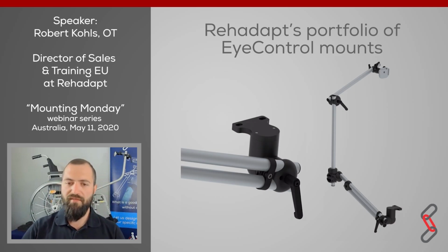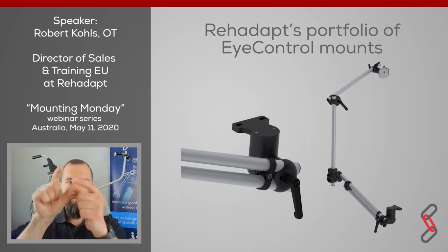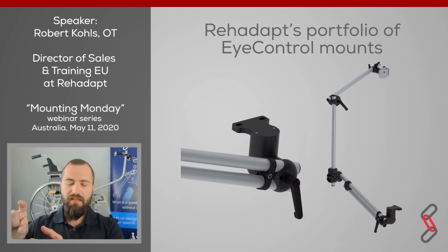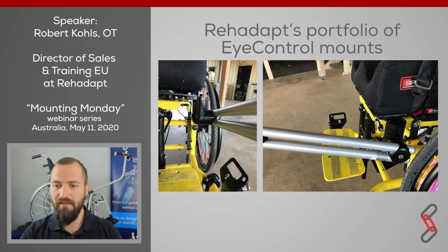This is what we suggested. We would use a frame clamp that could be attached directly under the seating plate, combined with a 90 degree adapter that moves the double tube construction to the side and holds both tubes over each other. This construction will also follow the direction when the wheelchair is tilted, and the kid can then access the device, good and stable enough.